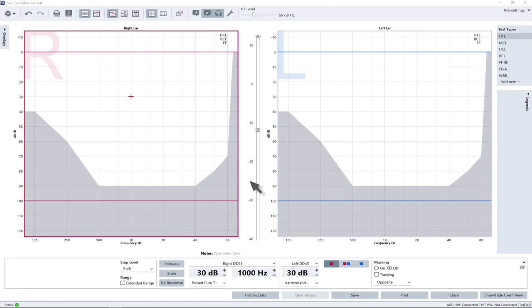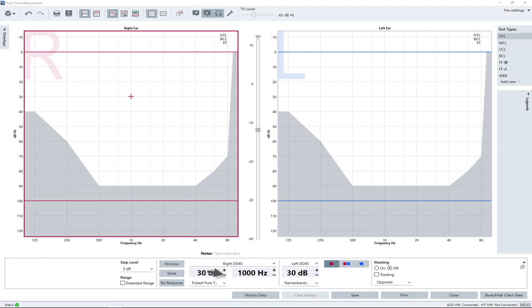To present a tone, click on the stimulus button. The sound level can be adjusted with the plus or minus buttons or with dedicated keys on your keyboard. To present another tone, click on the same button again. Repeat this procedure until you reach the threshold level of your client.